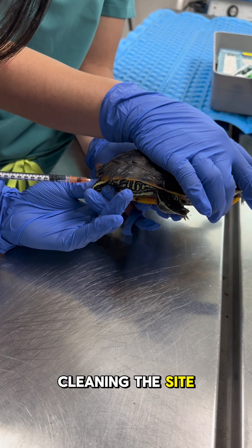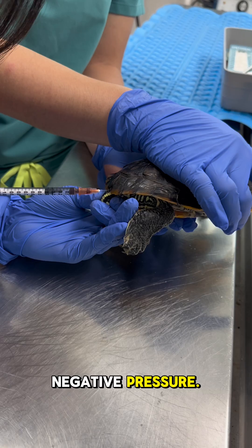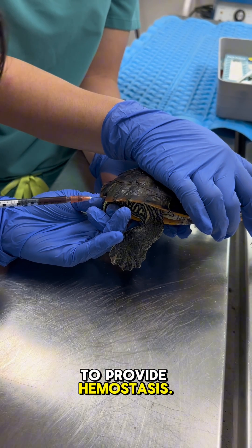We start by cleaning the site with alcohol and the needle is inserted on a dorsal midline at an angle between 45 and 90 degrees, while applying gentle negative pressure. After the venipuncture is complete, firm but gentle pressure is applied to provide hemostasis.